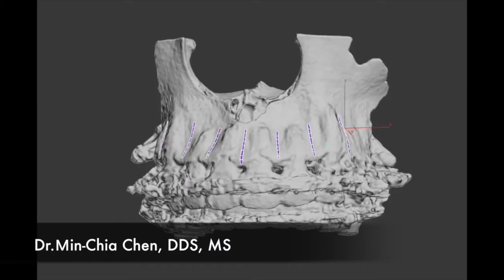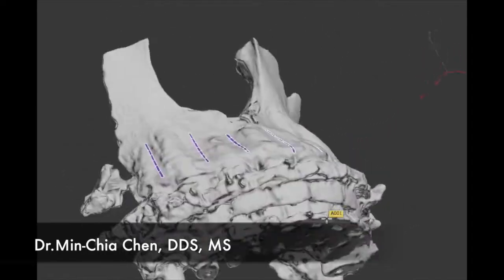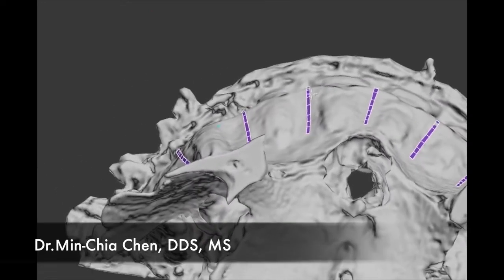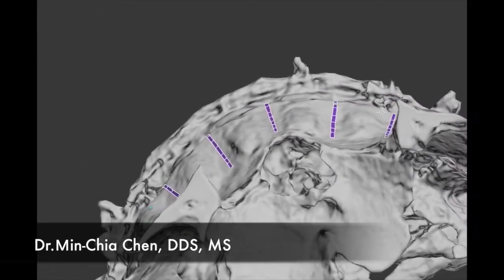Here is where the CAPG comes in. Clinically, maxillary impressions were taken and scanned as 3D digital files. On radiographic examination, the CBCT image was reconstructed for preoperative diagnosis and virtual surgical treatment plan. All digital files were then incorporated into a CAD software.